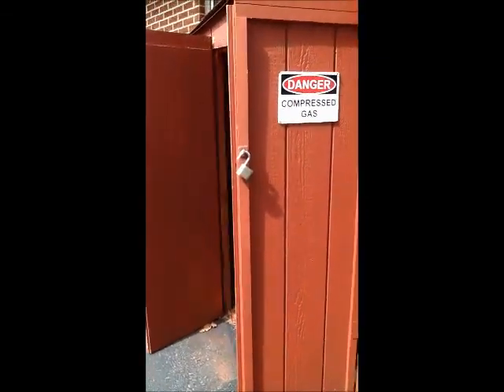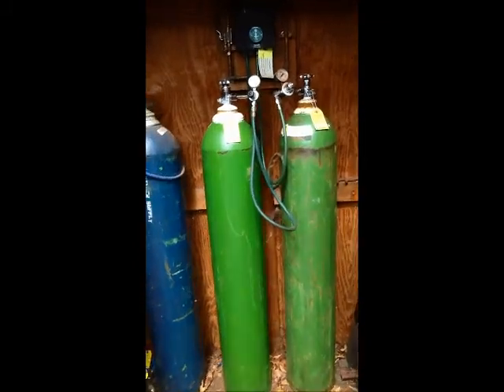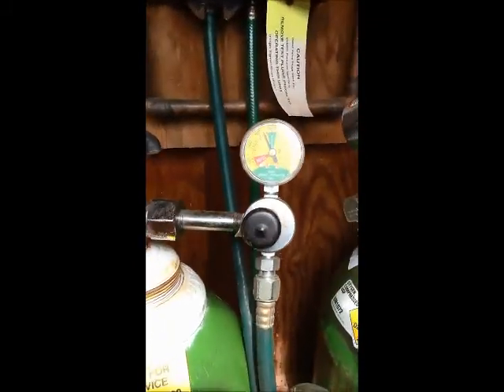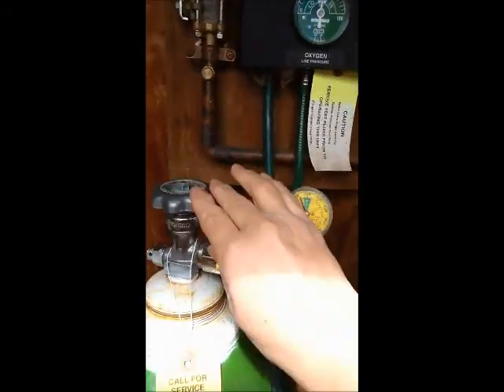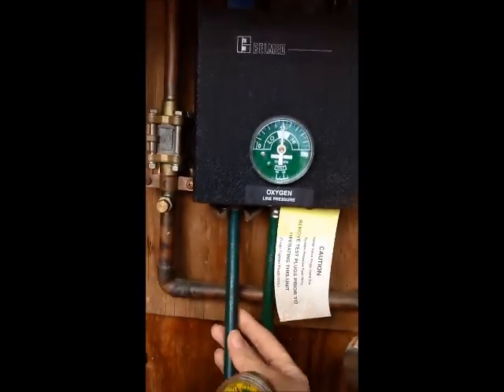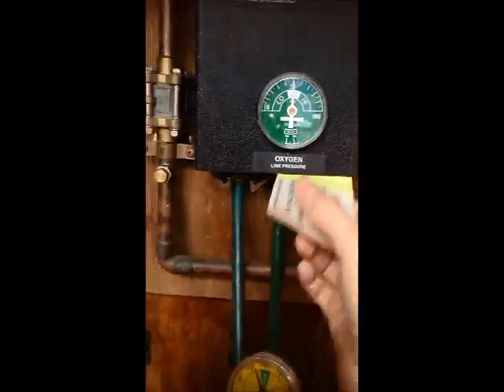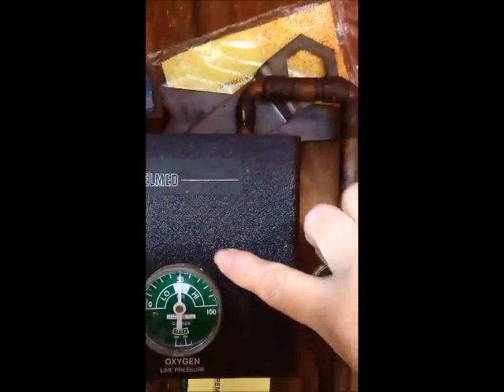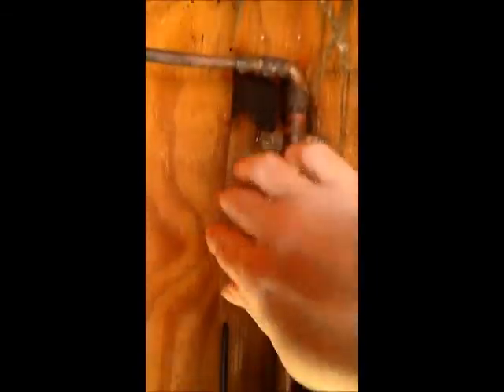Our oxygen is housed in a shed outside. These are our oxygen tanks. They have the 5-foot tall tanks. This tank is full. It leaves the tank, this valve is open. It comes out through these hoses into our box. This is our line pressure. It then comes through into this piping here, and up through to the building.